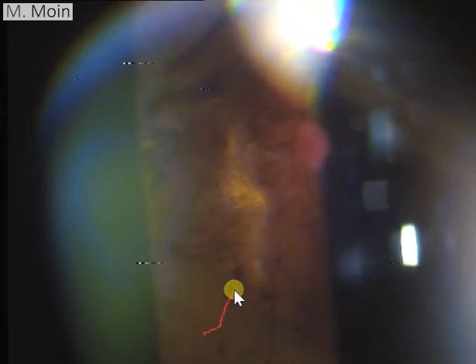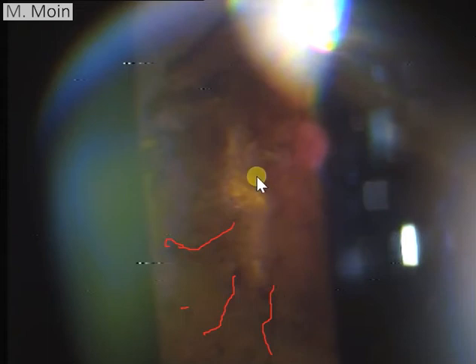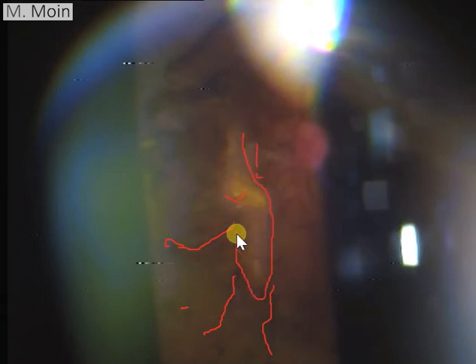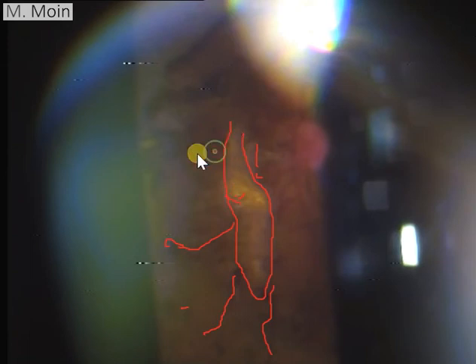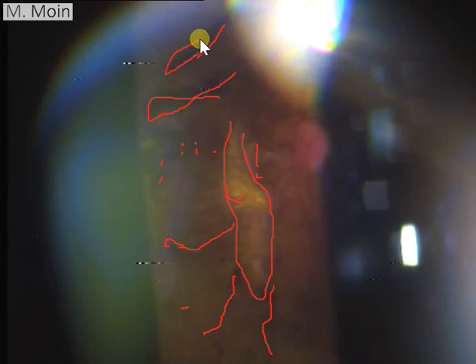Let's just go forward slightly and stop over here. Now we want to study what is the pattern of this. This is the neovascularization over here and these are hemorrhages on top of that neovascularization. This neovascularization has actually started from this area and you can see some fibers of the neovascularization. This is the fibrous tissue around it, and obviously there's area where it is bleeding over this area, and this is where it is produced that pre-retinal large type of hemorrhage in this patient.